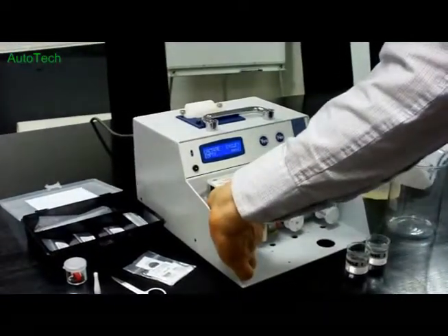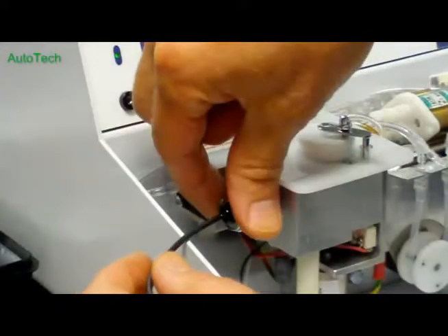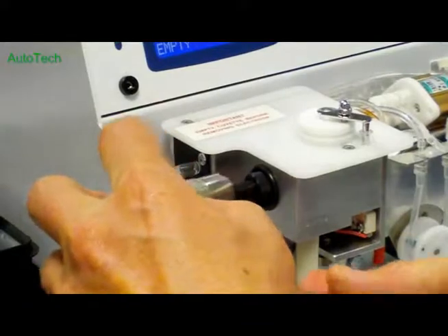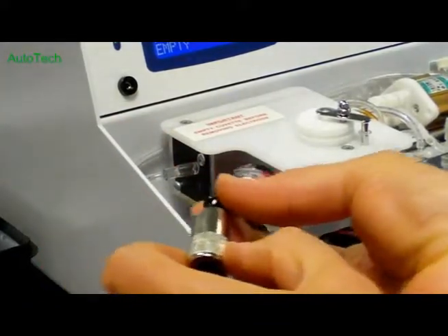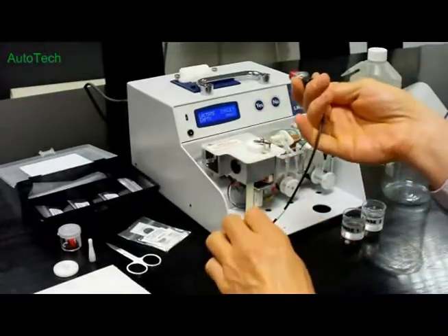So when that's complete, unplug the electrode from the bulkhead and turn the bayonet fitting until it releases, and then withdraw the electrode.